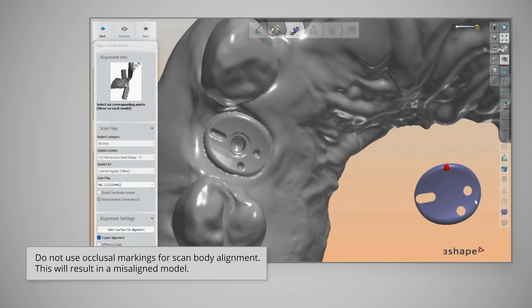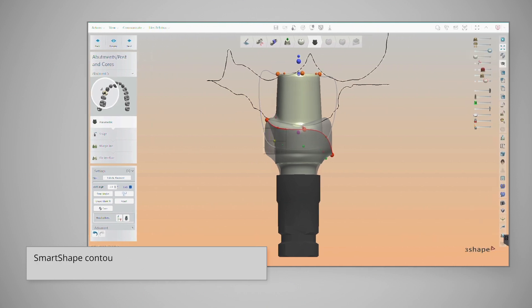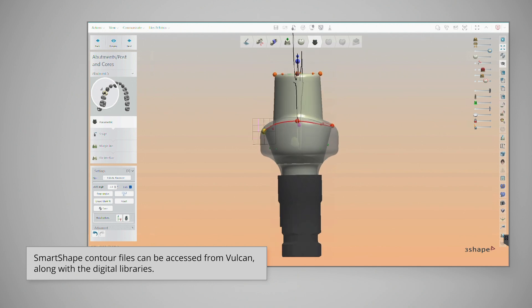Use a three-point selection mode to align the scan body file with the scan. Points should be selected around the occlusal profile of the abutment for ideal alignment. As the final abutment is designed, the emergence profile of the SmartShape healer can be used like a soft tissue scan, allowing the final abutment profile to match the anatomical healing abutment profile.